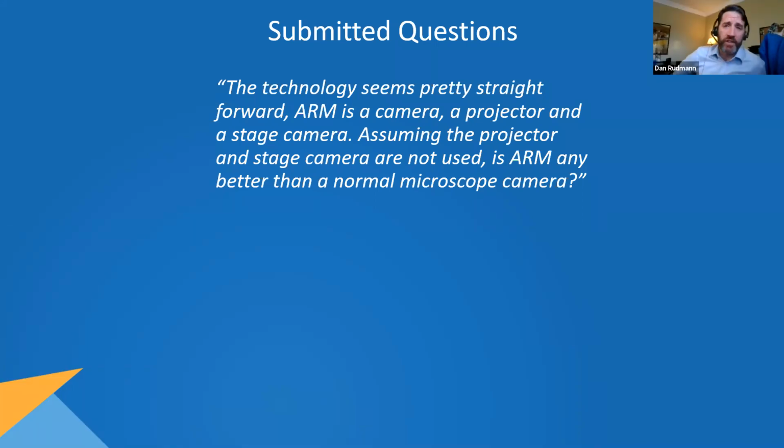Yeah, exactly. Just basic cameras don't have the ability to integrate AI and machine learning and everything in it. So that's really the difference, right? It's basically just a telepathology tool, or just a tool to take pictures for communication and presentations and things. But an ARM system will have the benefits of both: the computer-assisted machine learning type of technology, along with the digital camera technology. So you're just getting more, as was said.